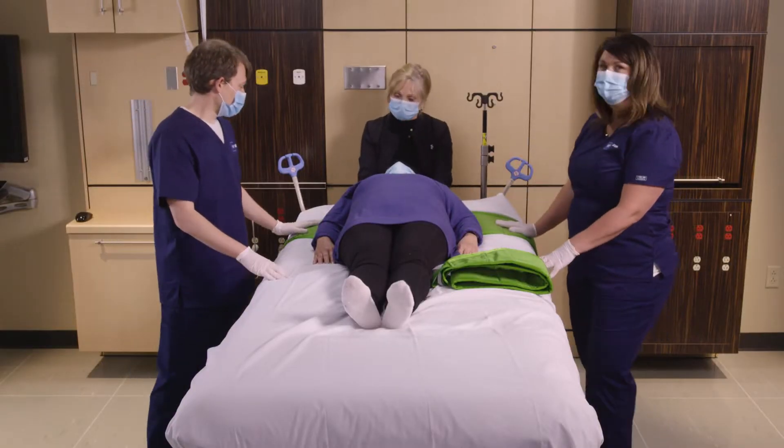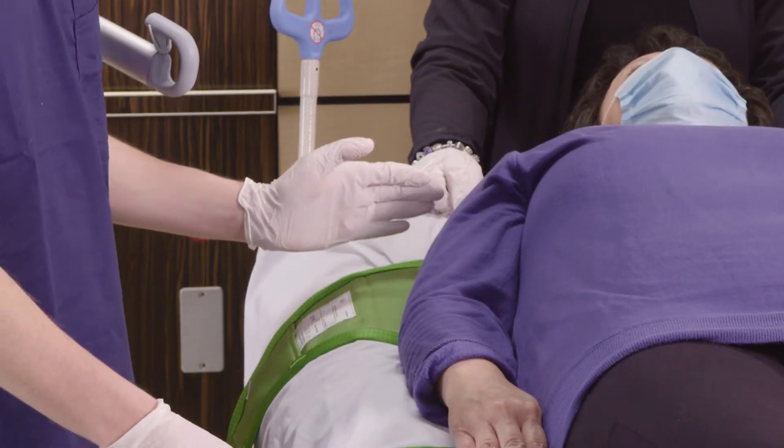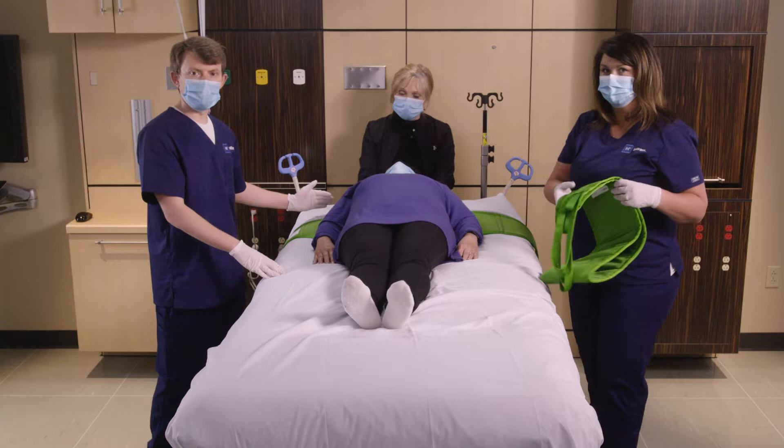We've placed one strap under the patient. You'll notice this upper strap — the top of the strap is aligned between the armpit and the top of the shoulder.